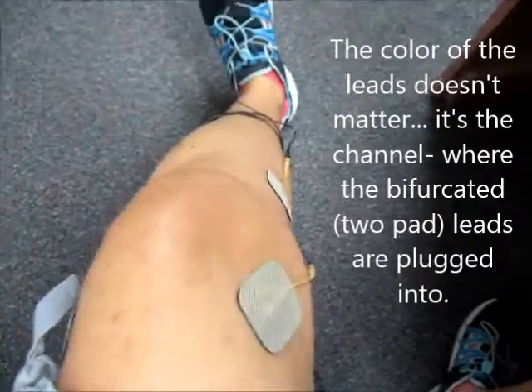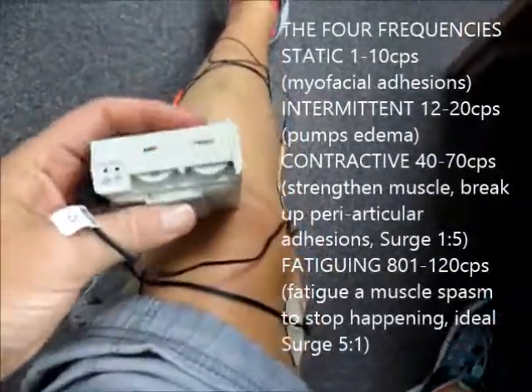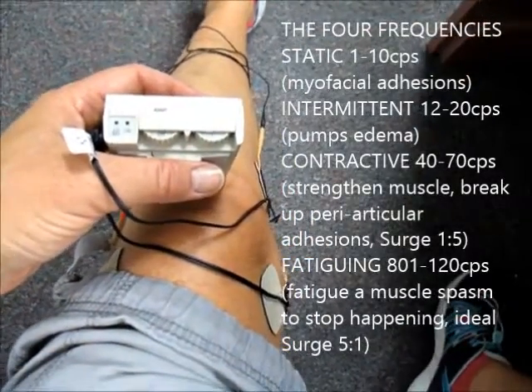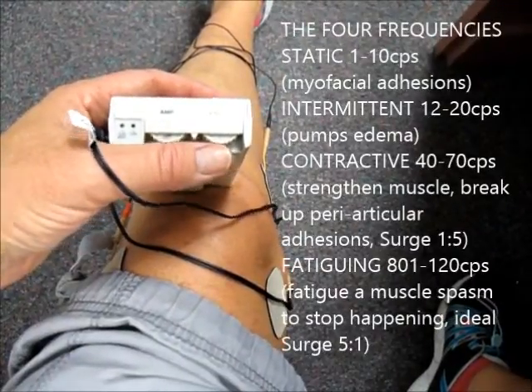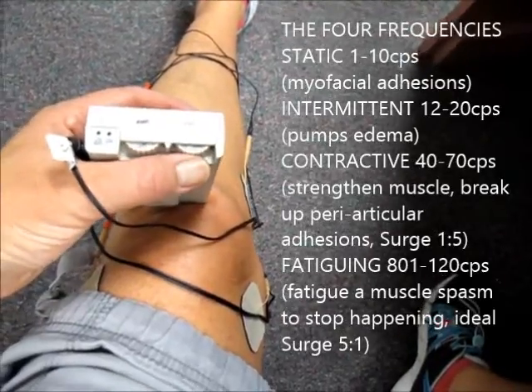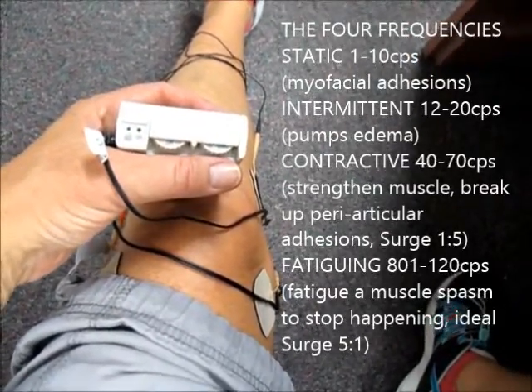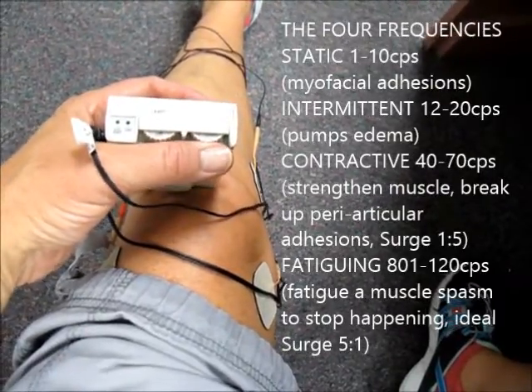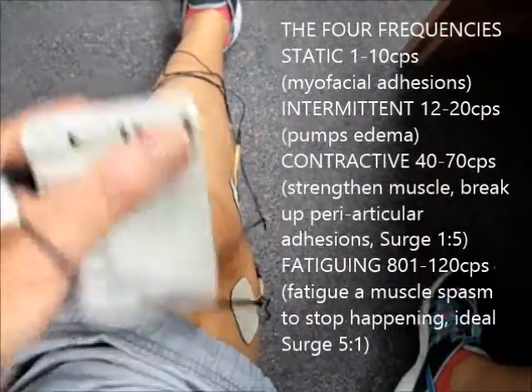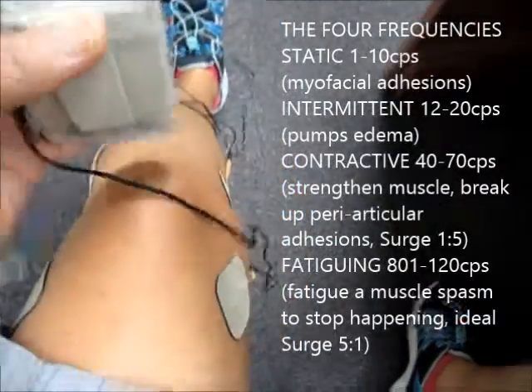So the different settings again — just to remind you the four different frequency settings. When you set the frequency down to around one, that's 1 to 10 cycles per second, which is for myofascial adhesions — breaking them up. Switch it up to maybe 15 or so — anywhere between 12 and 20 cycles per second is good for intermittent pumping. So that's what I would do if there's a swollen knee. I would go up to 40 to 70 if I wanted to start strengthening, and I'm going to do a new one on the quads to show you how to strengthen the quads with quad sets using that contractive setting.